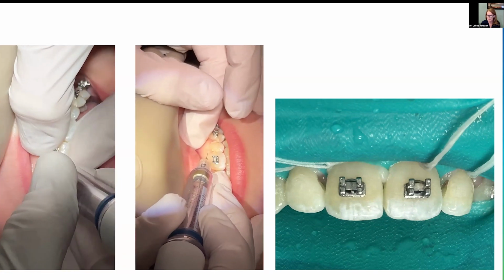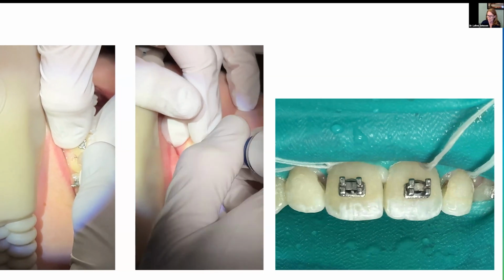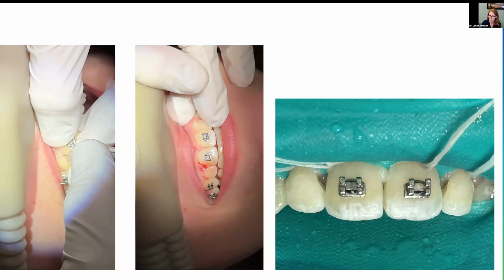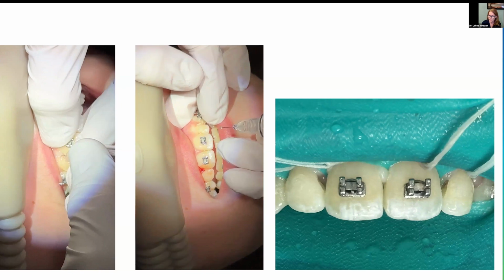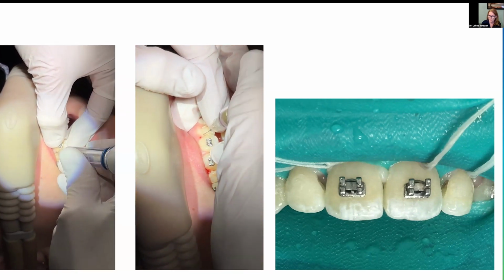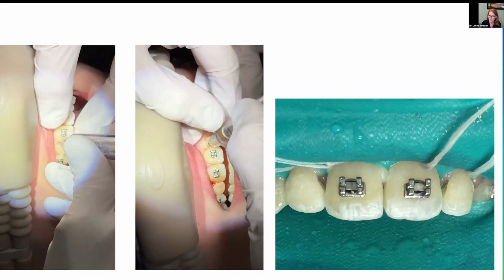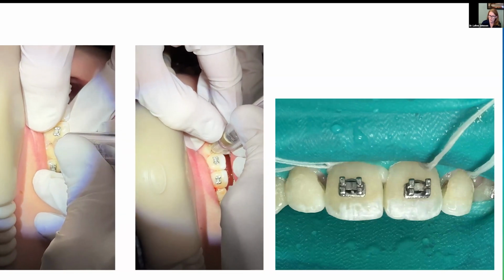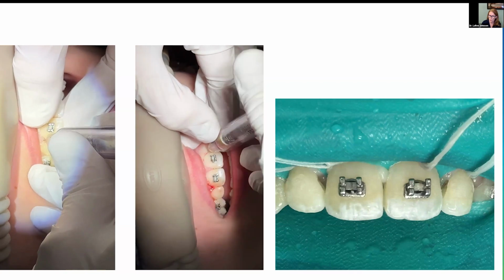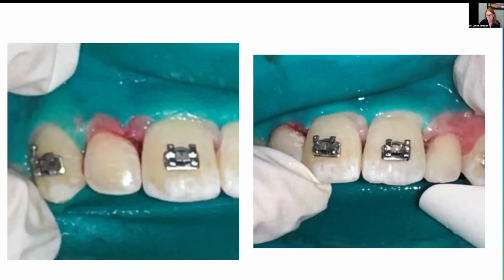And it's okay. If you're not sure you felt the drop you want, it's okay to come out and drop back in, because guess what? They don't feel that. Everything is really great. And you're just going to come in, you can see this one, and we're going to rotate, rotate. And I like to stabilize the other finger, and there it goes in about 1 millimeter out at that point. And this is after we got her fixed up.